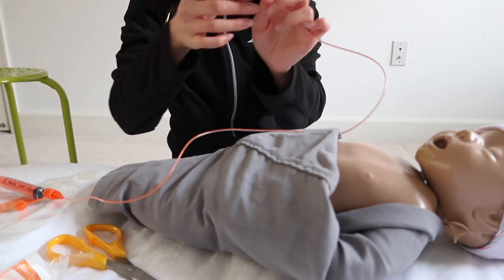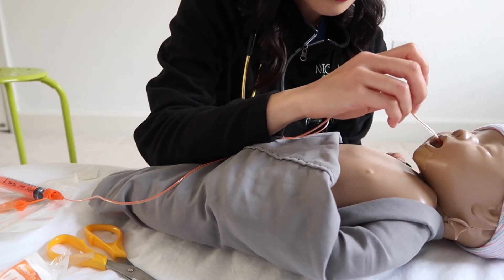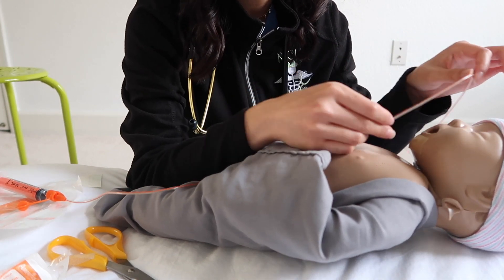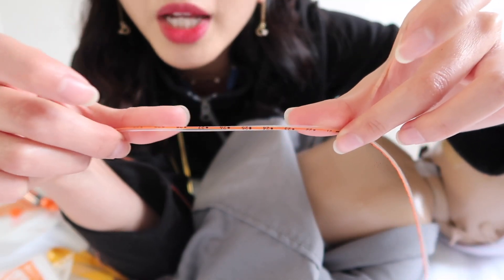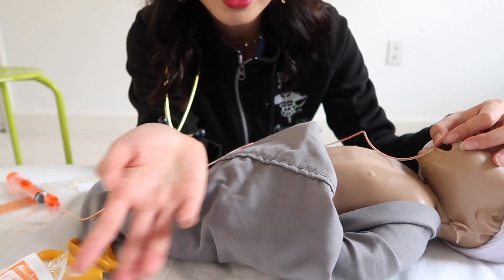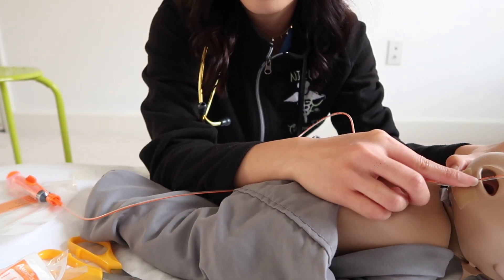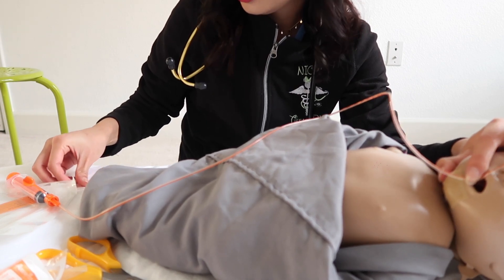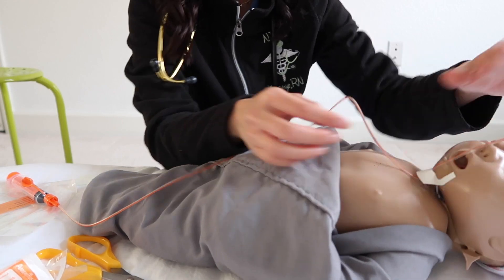Once your baby is settled, get your tube ready. Slide it in gently toward the back of the throat. There are little black dots on the tube marking measurements. When you've reached 23 centimeters, your baby will likely start coughing, gagging, or screaming — make sure they're swaddled tightly. Make sure the 23-centimeter mark is at the lip, since we always count by the lips. Once in position, hold the tube with one hand and use the other to grab the Tegaderm piece and secure it.